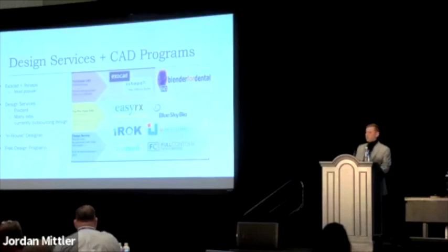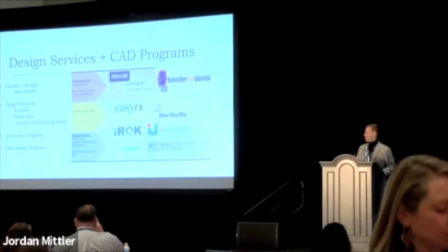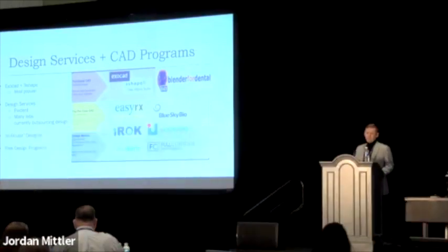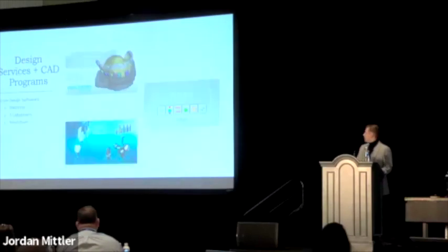And there's also design services. It does seem like new design services are popping up every week. Evident is one of the very large ones that's based in Vancouver. I've used them many times and with great results. Since I'm working in a full arch center and doing same day provisionals, having what I would call an in-house designer is something that's a total game changer for me. And I have in-house in quotes because, as long as they have electricity and the internet, they could be wherever they are.